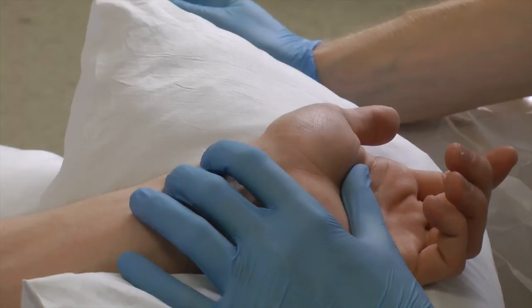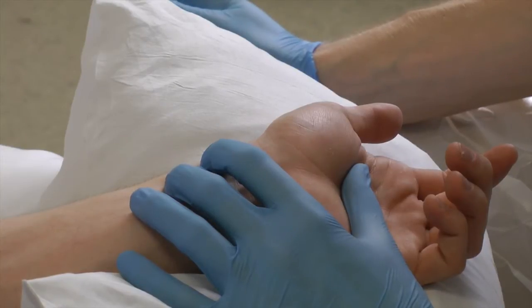Position and palpate. Take your time to palpate the radial artery. Spending time here is worth it, as by ensuring you have the optimal needle entry site, you can make this procedure a relatively painless one.